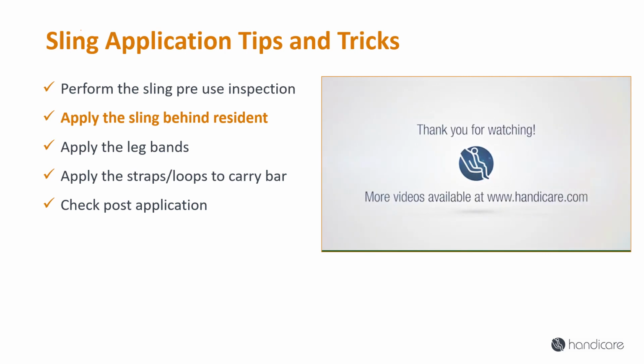Or another option may be to assess if a leave-in-place sling, like the Comfort Care sling, is appropriate if you are unable to apply and remove the resident sling.